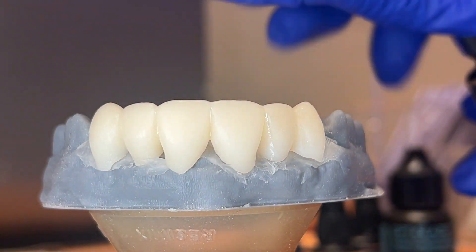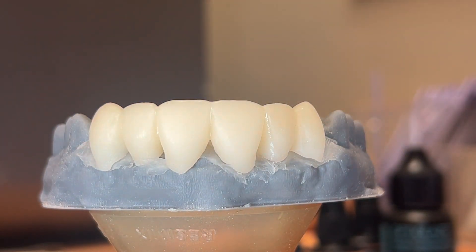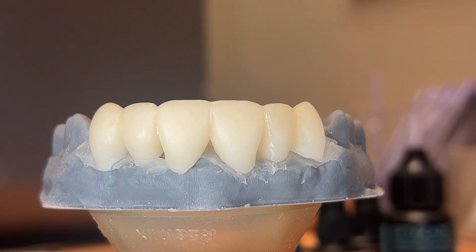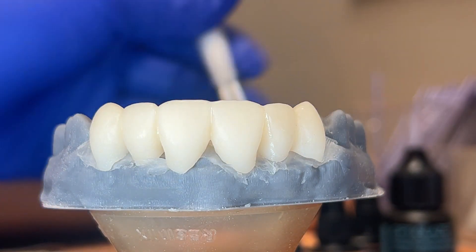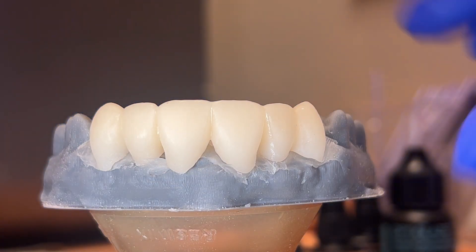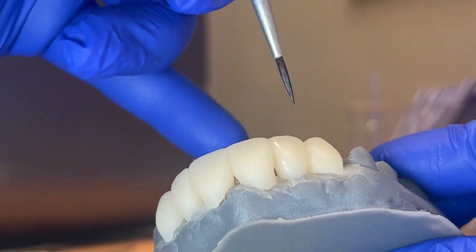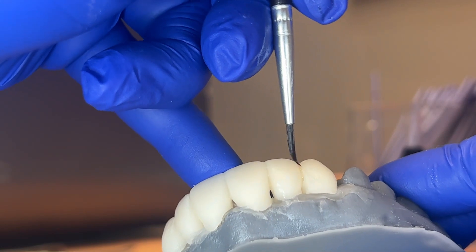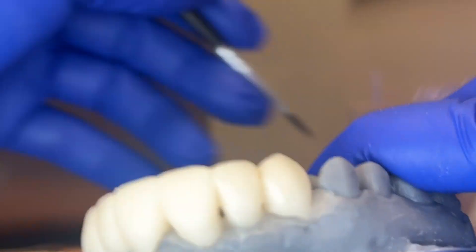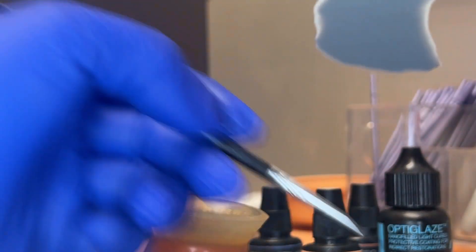First thing I always do is a little bit of olive in the embrasures. When I used to do this it would take me hours because I didn't like how it looked and I'd stop, start again, redo it, or print another one. But once you get the hang of it and you've done it a bunch of times, it probably takes about 15 to 20 minutes.